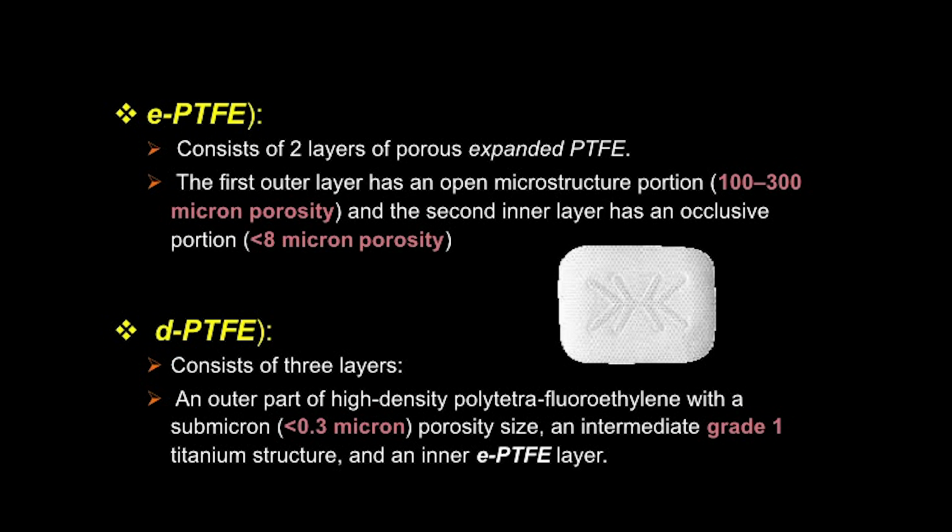The other kind is the dPTFE. It consists of 3 layers: an outer part of high density polytetrafluoroethylene with submicron porosity of less than 0.3 micron, an intermediate grade 1 titanium structure, and an inner expanded polytetrafluoroethylene layer. So it comes in 3 layers: outer, intermediate, and inner.